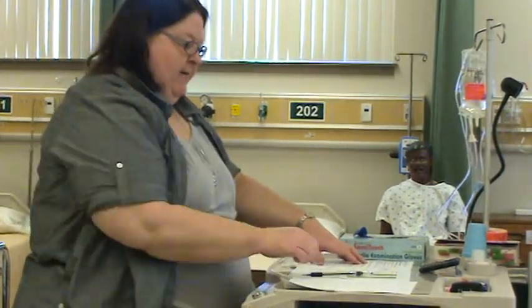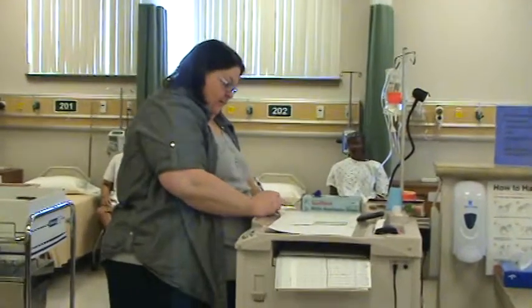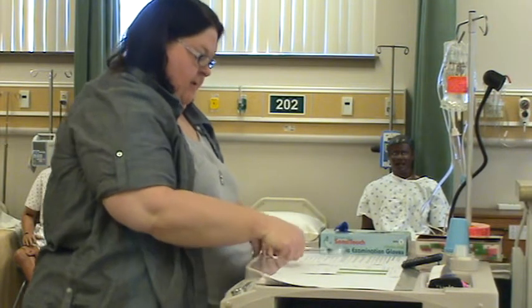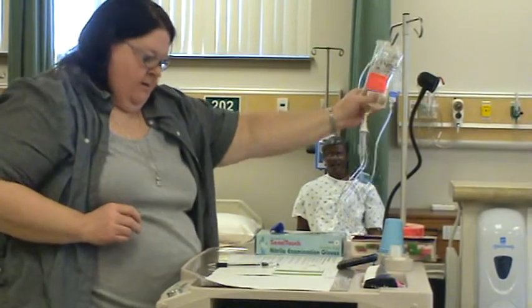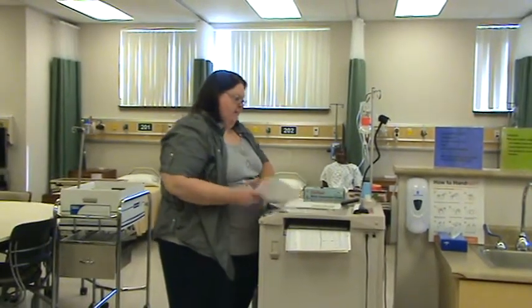I'm going to label the bag — put the date hung, time hung, and my initials: 5-8, 10:20, SW. This sticker goes below the Med-Added sticker on the back of the bag. We are ready to go into the room and hang this medication on the patient.